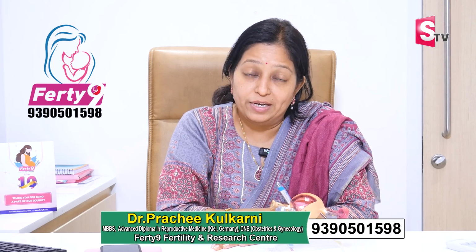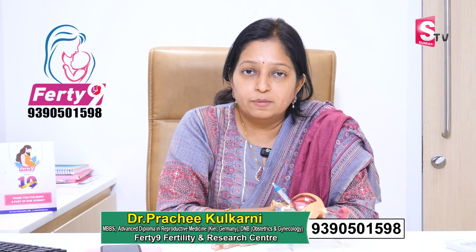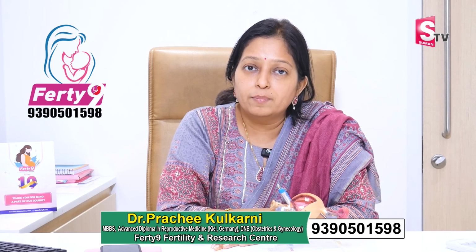So we usually advise these procedures before the IVF embryo transfer cycle. If at all there are failed transfers, or if at all there is presence of polyp or septum or submucous fibroid, we can correct these factors and improve your chances of pregnancy.